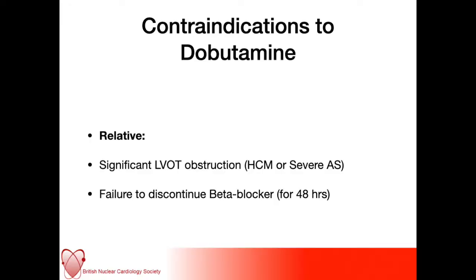Again, left ventricular outflow tract obstruction related to hypertrophic cardiomyopathy or severe aortic stenosis is a relative contraindication, and the patient should be off their beta blockers for 2 days beforehand for the test. Otherwise, that will blunt their tachycardic response that we're trying to achieve.